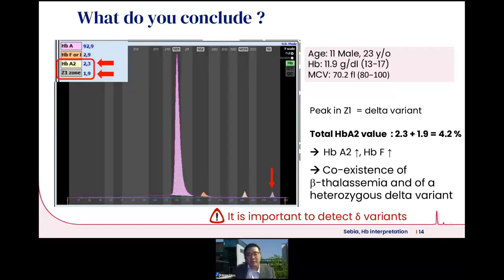So we combine the hemoglobin A2, that is the normal A2 value, and also the delta variant composition values. And this combination gives you 4.2%, which is higher than the normal reference range of hemoglobin A2. Also, you see an increase in hemoglobin F, which is very likely indicative of an underlying condition. So most likely, this is a coexistence example of beta thalassemia and also a heterozygous delta variant. Note that it's very important to consider the true hemoglobin A2 value to detect the underlying conditions.